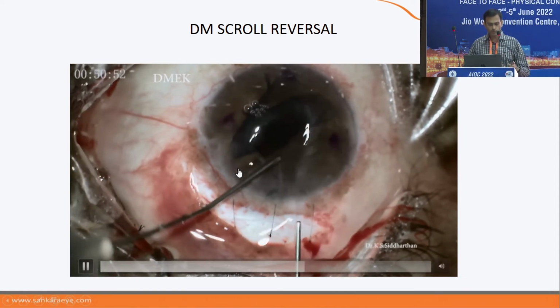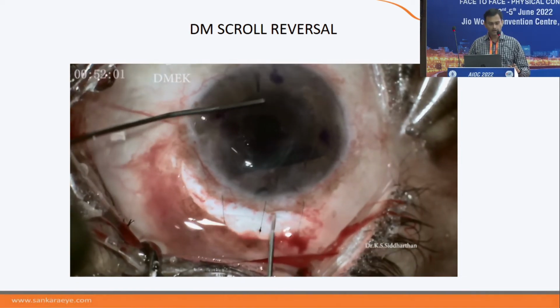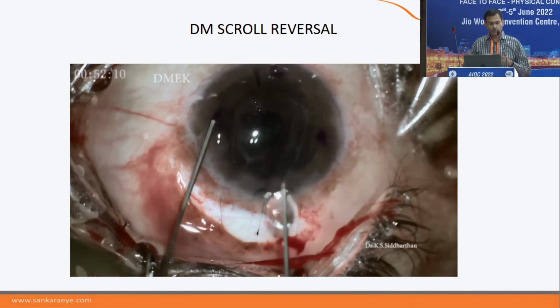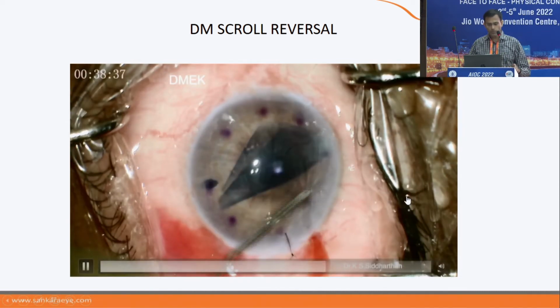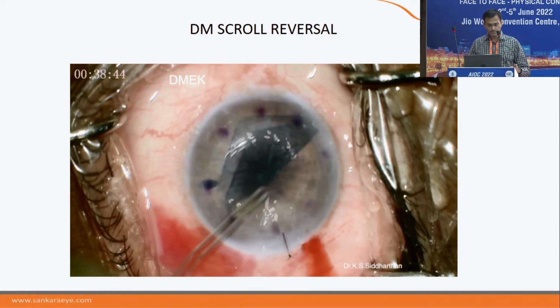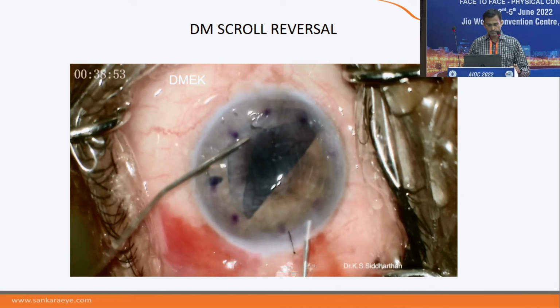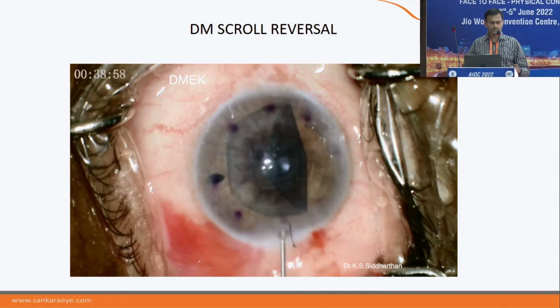I'll show you one more video also. So once it reverses, hold with your left hand and you unfold it. So that's how you have to give the saline under, and that's how it moves in. And I'll show you one more where, again, here I'm trying to unfold. Once I unfold, I will find that it's not in the right side.